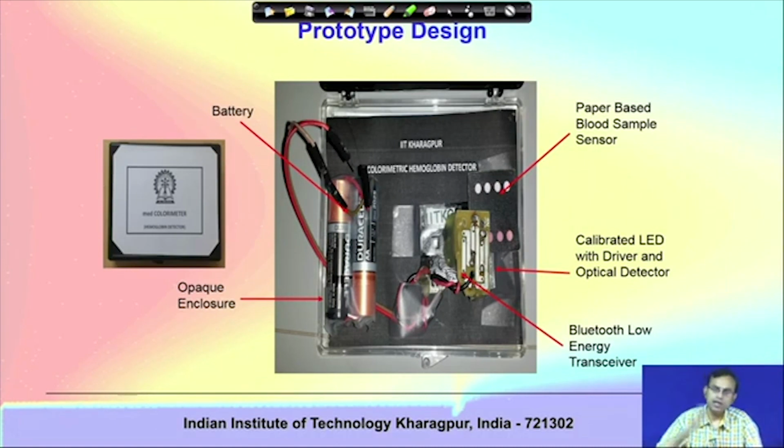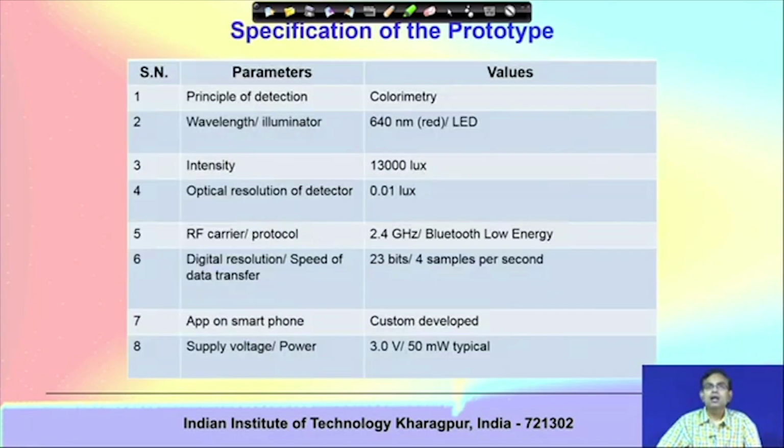Of course, it is battery operated. So, currently research is going on how this battery operated technology could be improved in a sense that using low power or even the streaming potential that is generated from the transport of the blood sample within the device, this kind of device could be self energized. So, that could itself be a remarkable advancement in the technology, where such devices become more and more independent of the power supply.